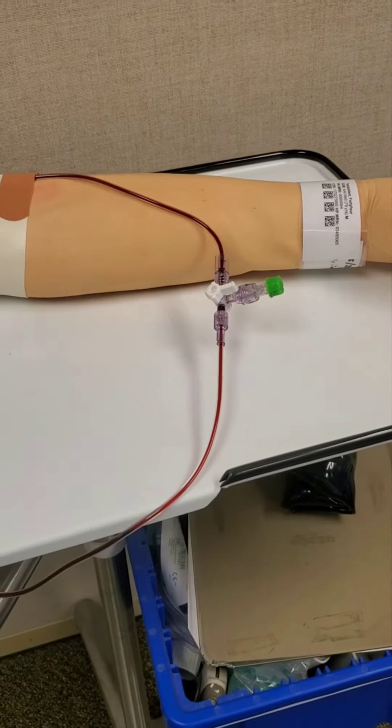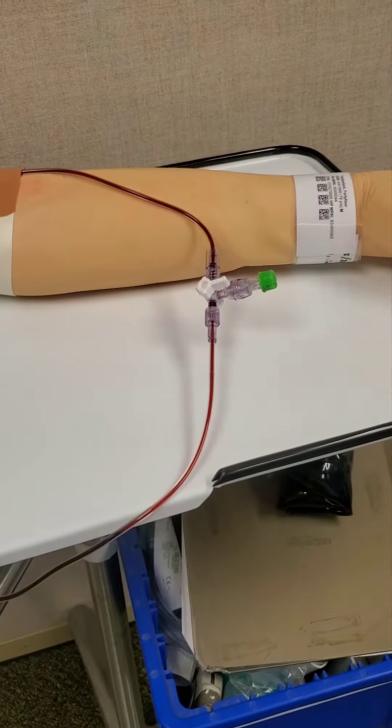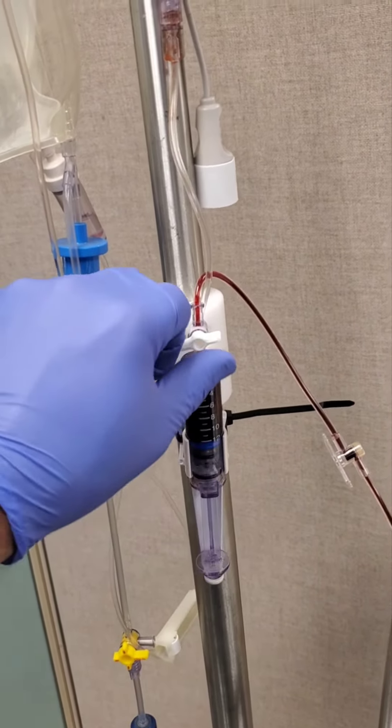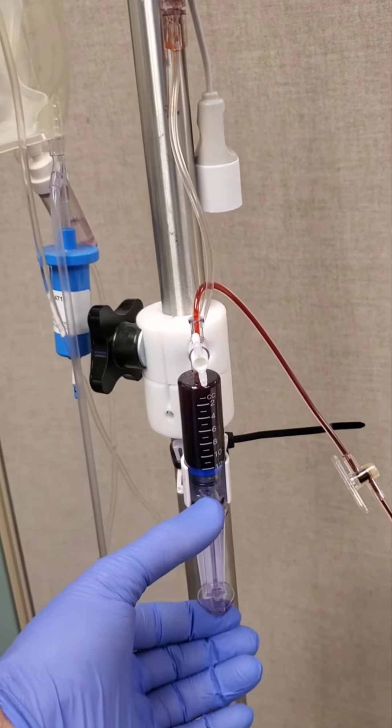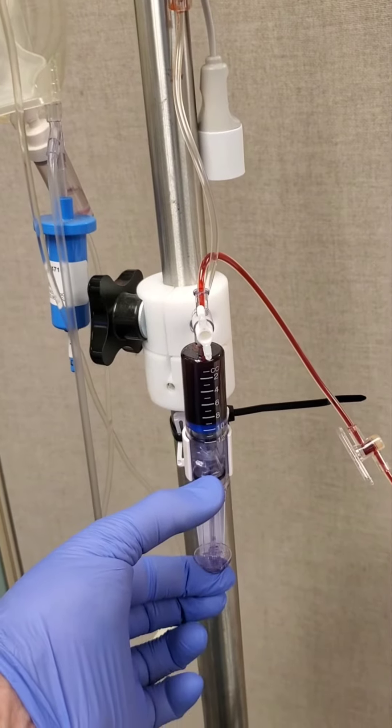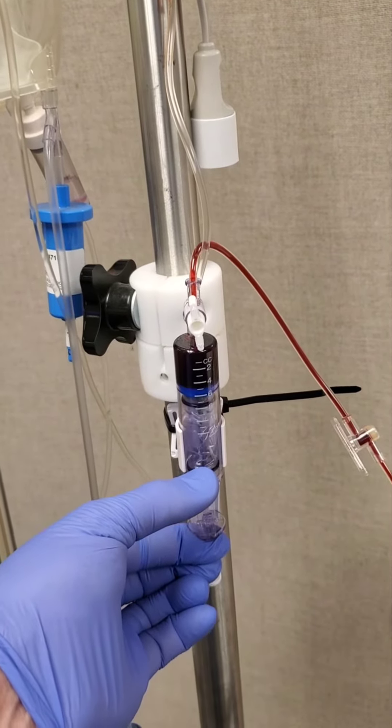Before we are done, we must flush the blood out of the A-line. Start by coming to your syringe, returning the stopcock to the up position, and push the plunger back up until you hear a click.